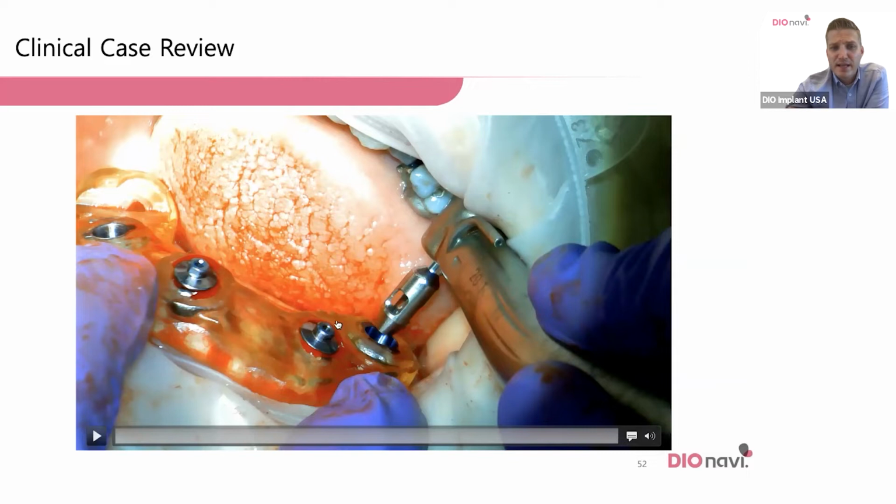5 or 6 implants. These things right here are a special fixed pin, we call it, that actually go into implants that were placed and help secure an edentulous guide even more. It doesn't have to be edentulous, I guess, but typically I use these on an edentulous case. And so I took out a bunch of teeth.